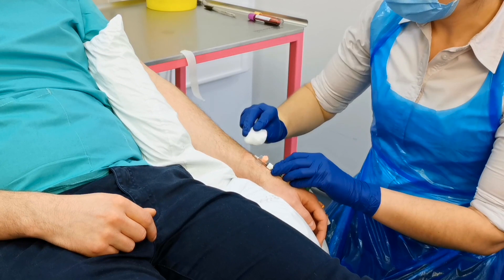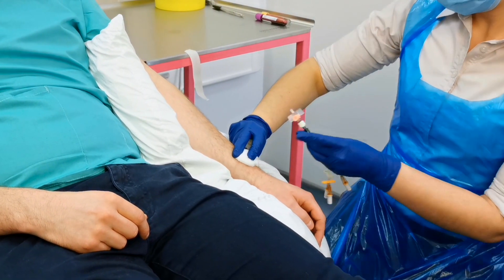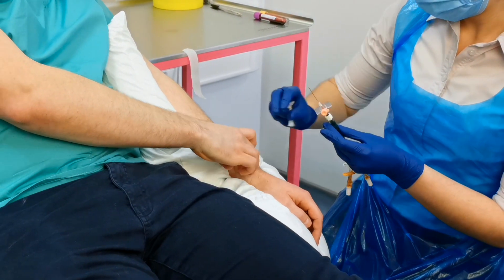The last thing to be aware of is accidentally cannulating an artery. It's really useful to check whether there's a pulse in the vessel that you're aiming for before you put the cannula in, but it happens to everybody. If you take your stylet out and you've got pulsatile flow coming back, take the cannula out of the artery straight away, put a dressing on with cotton wool and press hard for three to five minutes. When the patient no longer needs a cannula, ensure that it's removed appropriately: take the dressing off, get a piece of cotton wool or gauze ready, place it over the cannula and smoothly pull the cannula out of the vein. This should be painless. Dispose of the cannula into a clinical waste or sharps bin.